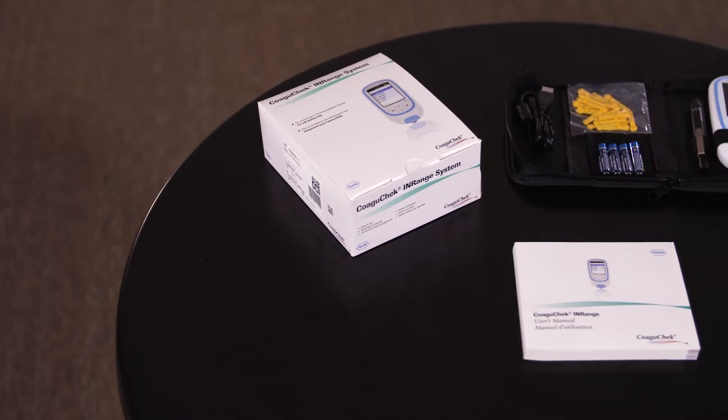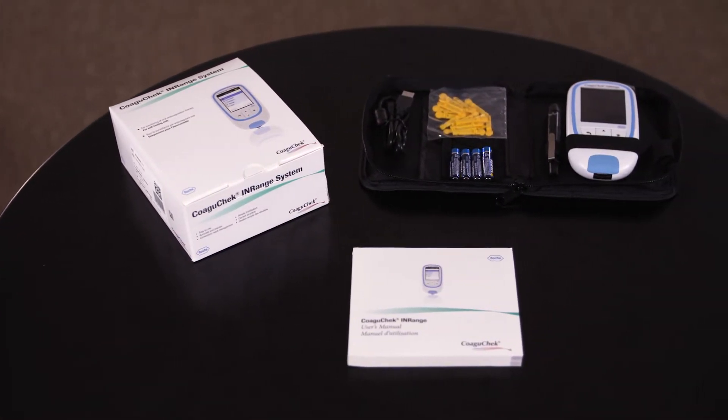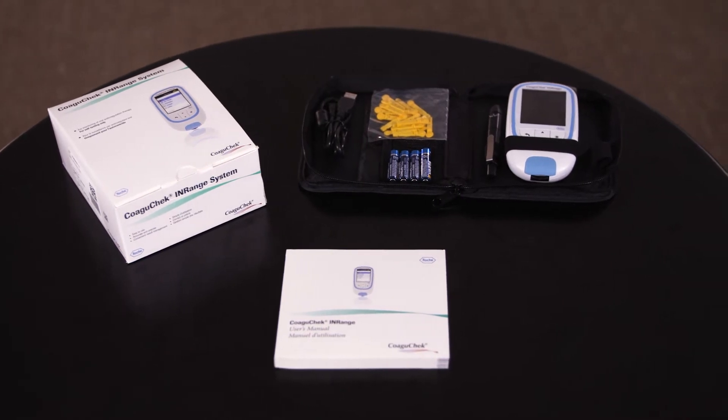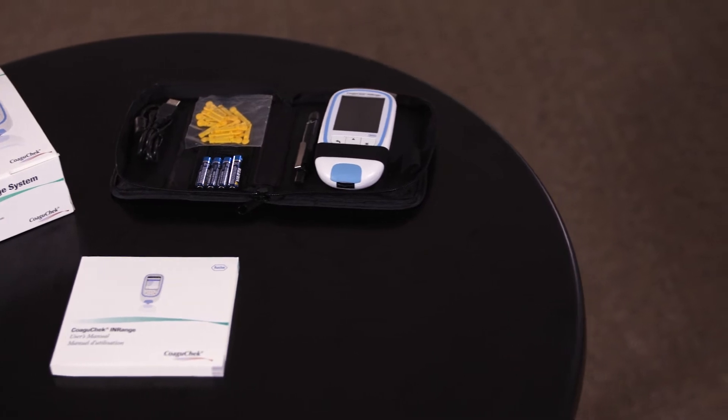When you receive your package you will get a box. Inside the box you will receive a manual and a carry case. In the carry case you will have the meter, the soft clicks pen, the USB cable, four alkaline AAA batteries and 20 lancets.